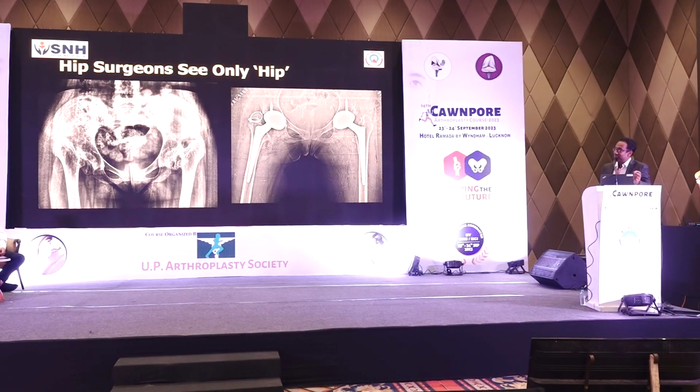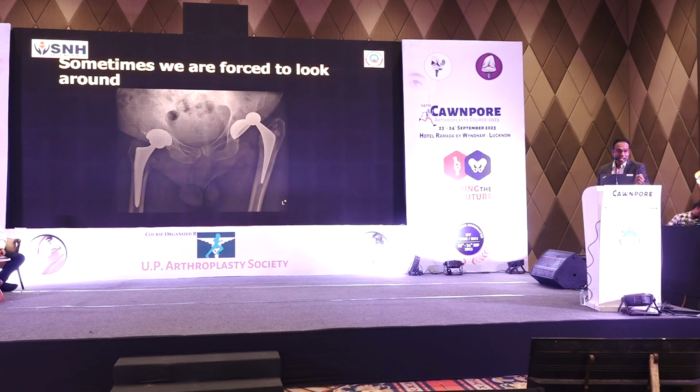I think we are hip surgeons. We concentrate only on hips. We get hips arthritic, dysplastic, dislocated, and we want to do something like this. Our entire concentration is basically on getting the version, getting the implant position right. And usually we are fine. Sometimes when we are faced with situations like these, we are forced to look around the hip.